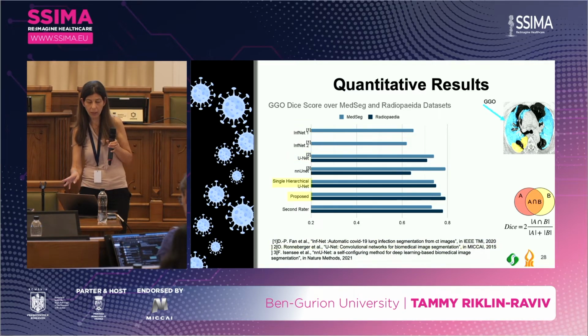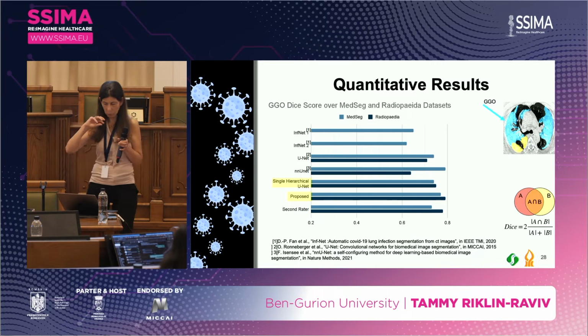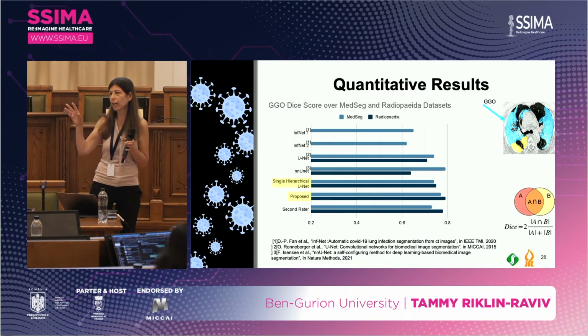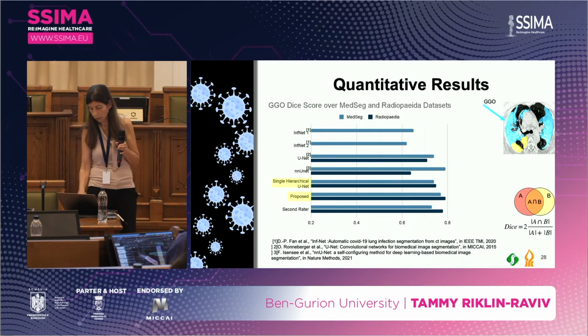With the NNUNet, well, we had a problem, because the NNUNet actually wins in all the medical challenges. So the key idea is as follows. It has training data, and it is also trained on the hyperparameters. However, as you can see, it is very bad in generalization.